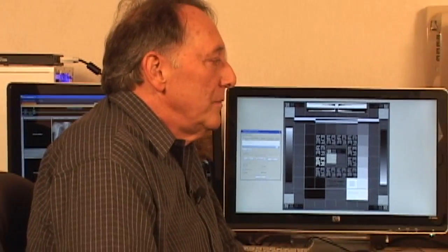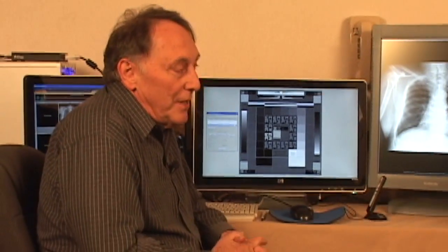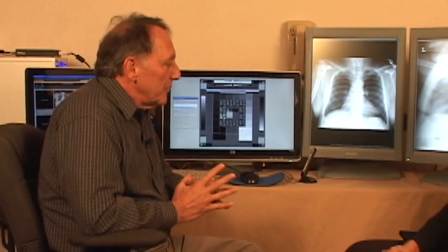3 to 5 years meaning 24/7? Yes, it would be. You can generally do that because when the monitors are calibrated by the factory, they don't drive them at 100%. We always targeted 75 to 80% of the lamp's actual 100% output as a starting point. So we always had plenty of room to grow underneath that, to increase the drive to the lamps to bring the light output back up.